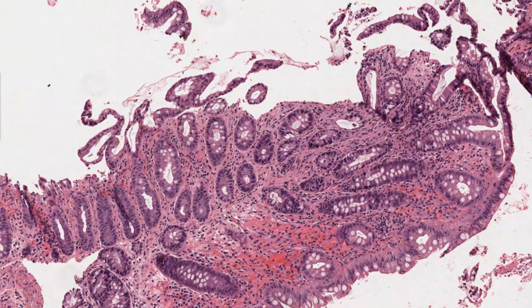And here you can see areas of hemorrhage and red blood cell extravasation, which a lot of us overlook because you might say the procedure can be difficult, the endoscopy tears the mucosa, all of this can lead to hemorrhage, but we will keep looking.